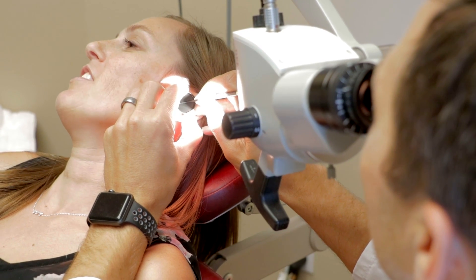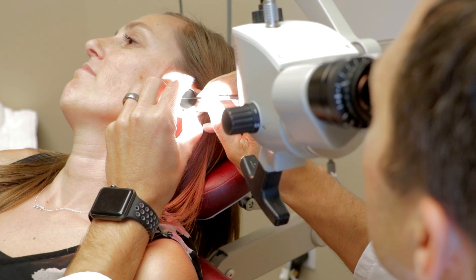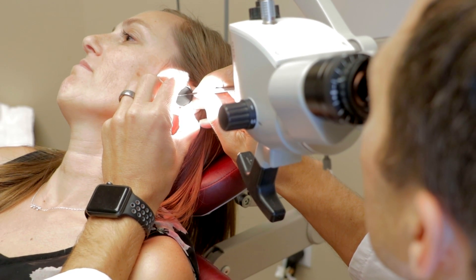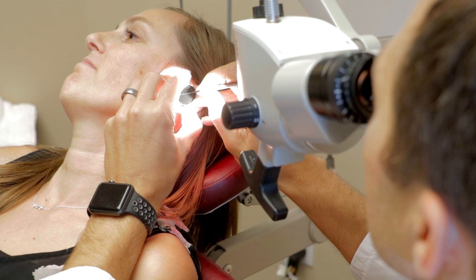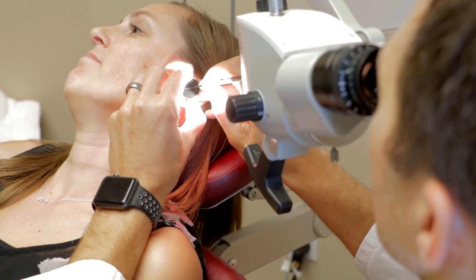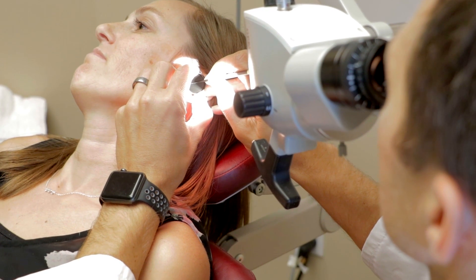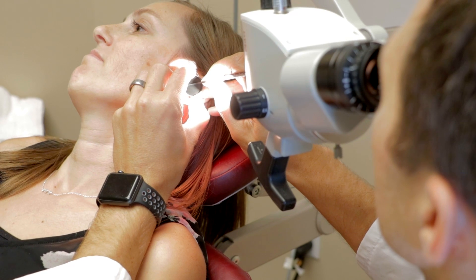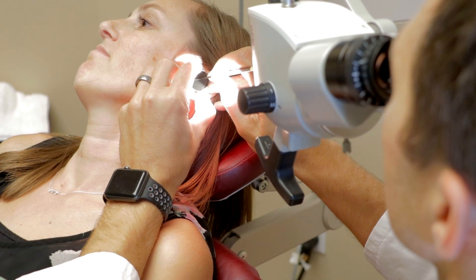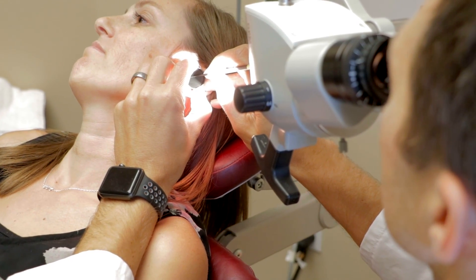Does that hurt? It's just a lot of pressure. Yeah. Your eardrum is super thick, and so that doesn't allow a little bit of compliance as I'm trying to push that tube through. Remind me — you'd had a ton of ear infections as a kid? Mm-hmm, yeah. Yeah, so you have a lot of what we call myringosclerosis, which is just scar tissue in the eardrum. It just kind of reduces some of the compliance as I'm trying to get this soft tube to squeeze through.